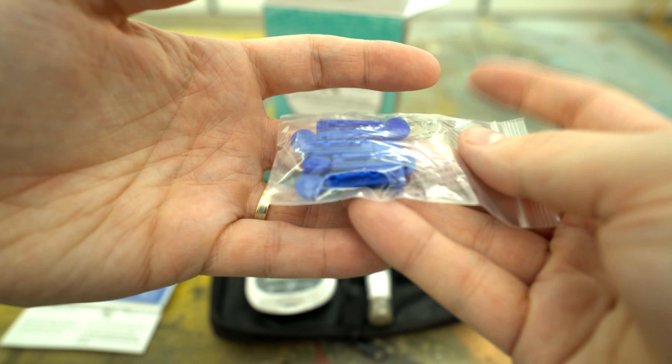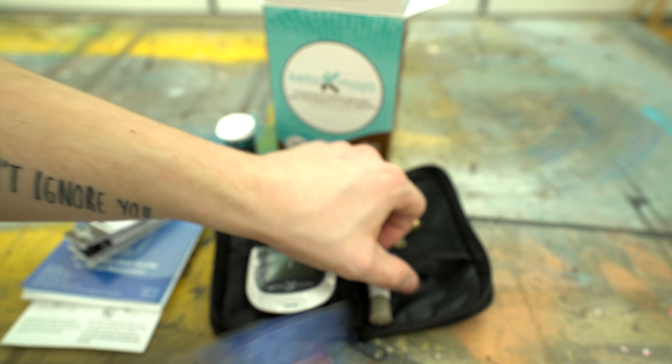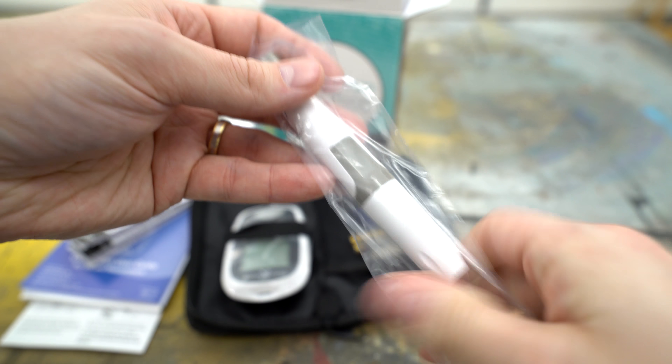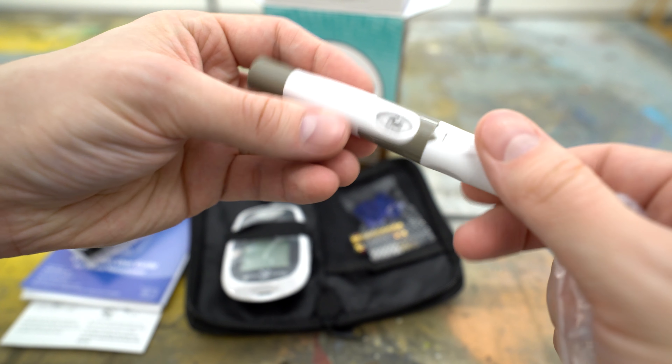The next thing I found in there was the actual lancets themselves — you do get a little handful of those. I've looked online and found them available at a lot of stores and also on Amazon. They're just small sterile needles to prick your finger and get your reading to the blood glucose monitor.